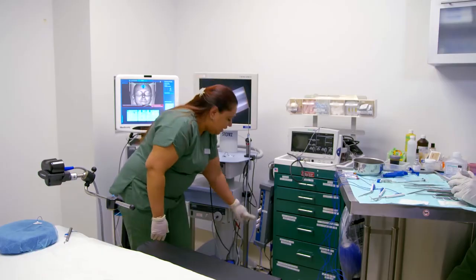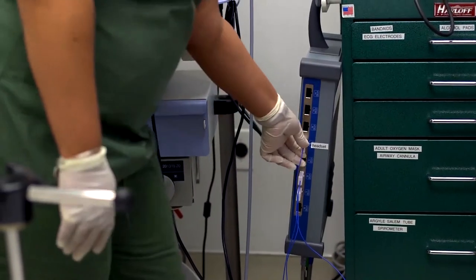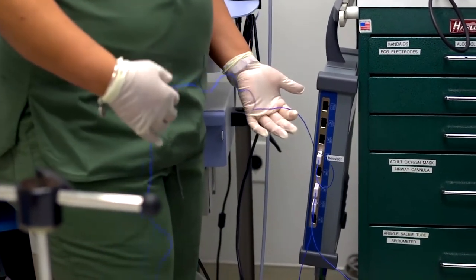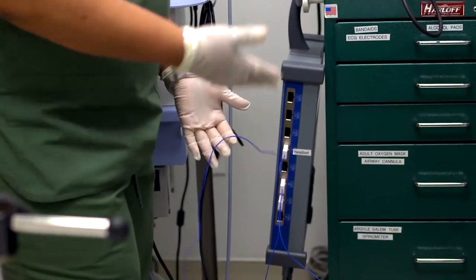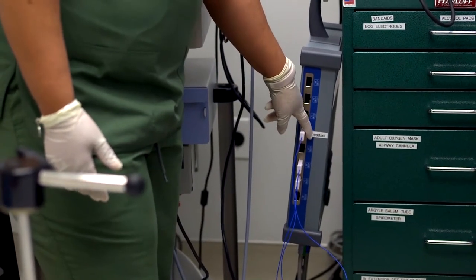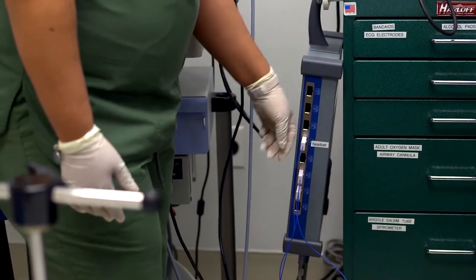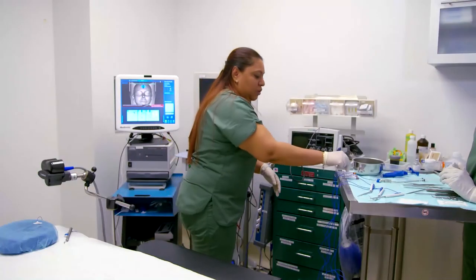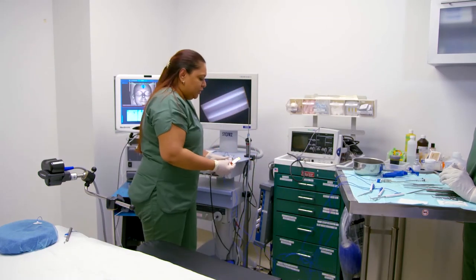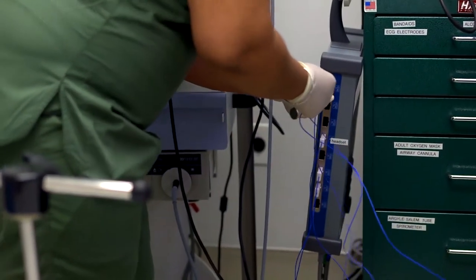If you notice, there is one that is labeled headset from the 8 ports, and this one we will never remove. So basically this one will stay in all the time, unless there's a malfunction, then you've got to put in a new one. But you always make sure that there's a label on it so it doesn't get pulled out when you pull out your balloons. We're gonna start by connecting all our balloons at the same time. It makes it easier because that way during the surgery, you don't have to keep pulling in and out, in and out.